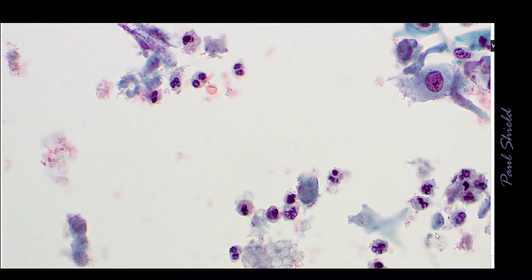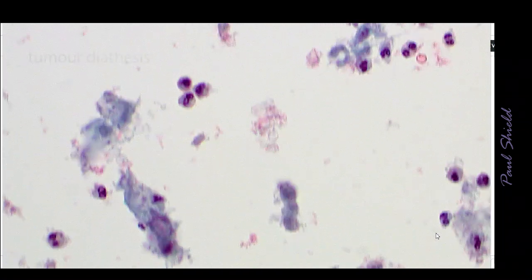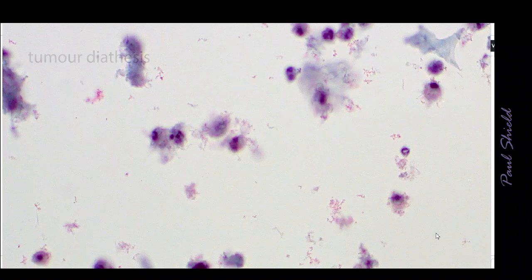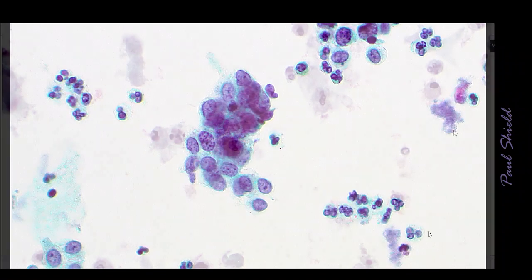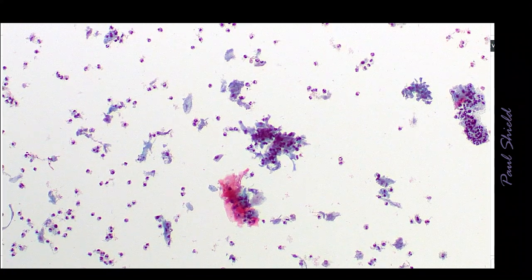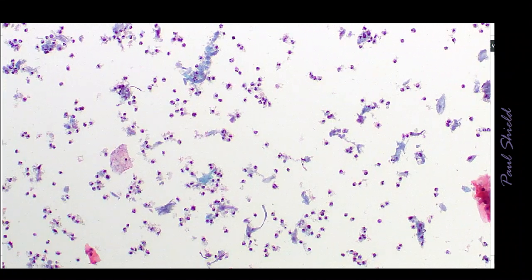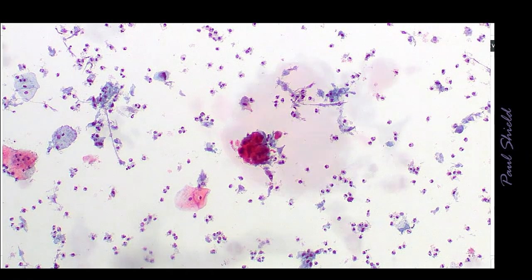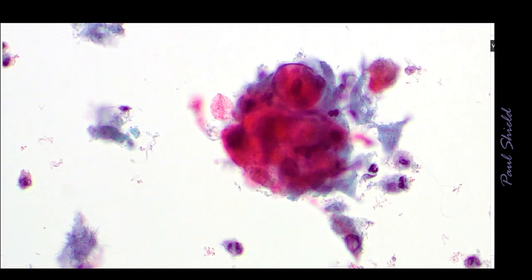Often a tricky thing is that this blocks the filter in thin preps, and so you get smears that are of really fairly low cellularity, and you have to go hunting for the cells. Often they'll be grouped together in what looks on low power fairly insignificant groups of cells, but when you go down on them, they actually have quite abnormal features often.